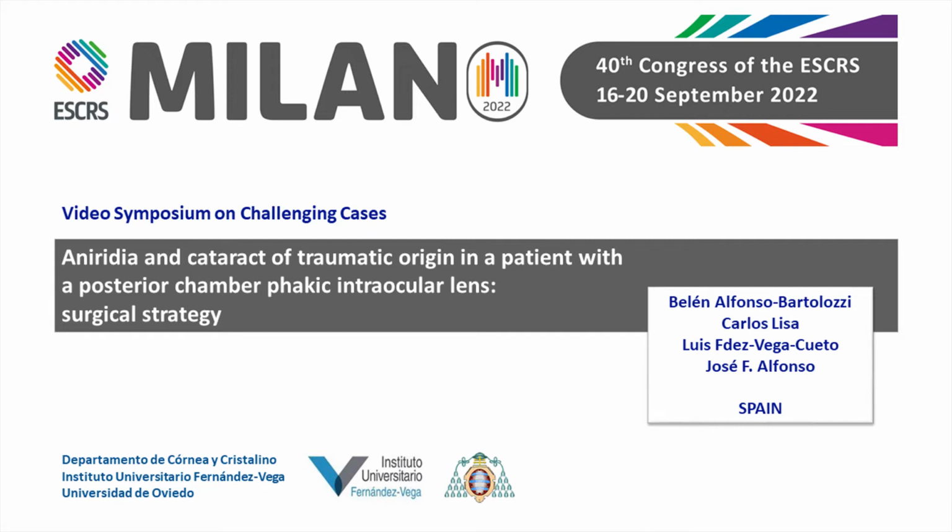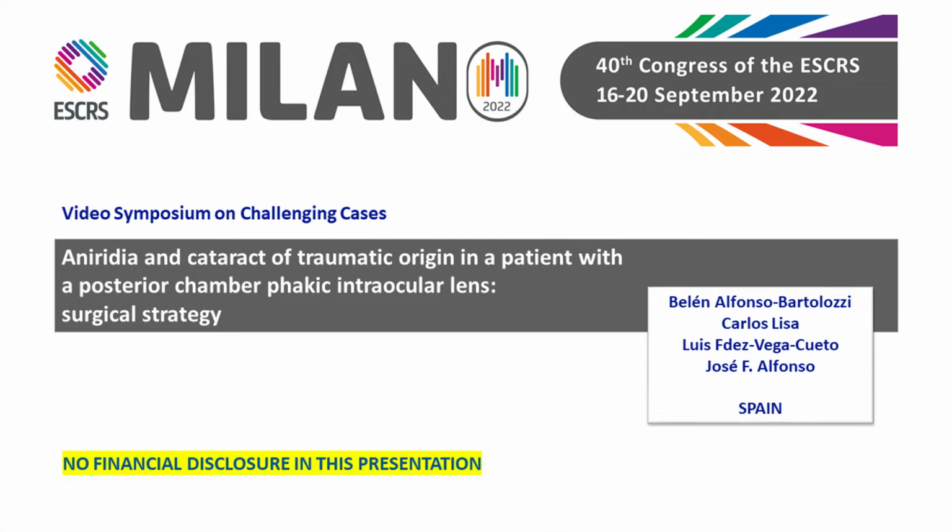We are going to present the following challenging case: aniridia and cataract of traumatic origin in a patient with a posterior chamber phakic intraocular lens, surgical strategy. The authors have no financial interest in the products presented in this video.